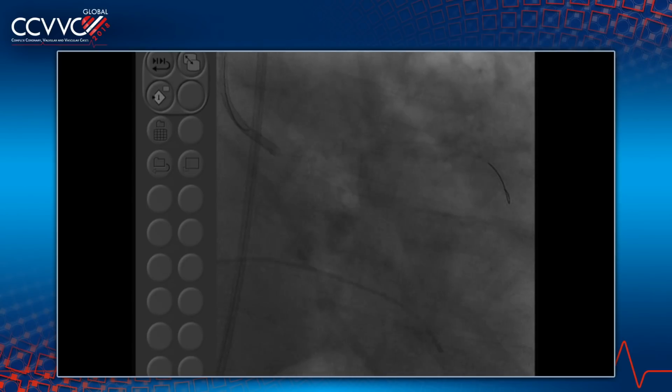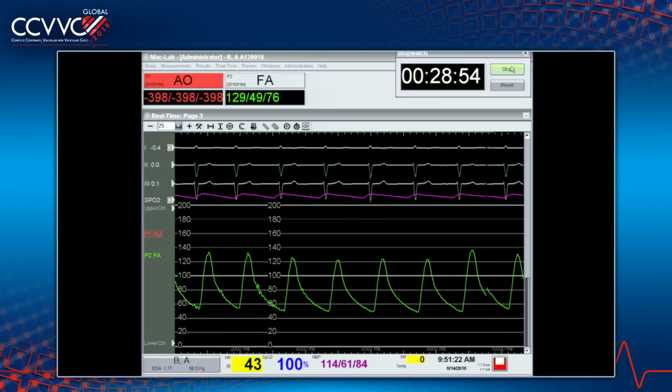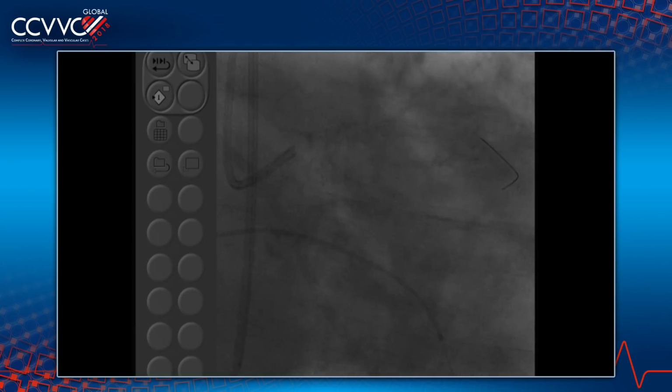You've got the momentum. Pressure is 160, 140 over 60 right now. Great result. I would agree. Let me also tell everybody, do not do TAVR now from the health point of view. Medically I still think they're two separate steps. In the left main registry of Raj, very few cases, less than 10%, had it at the same time as the TAVR. Most of them were done before, and that is the recommendation.